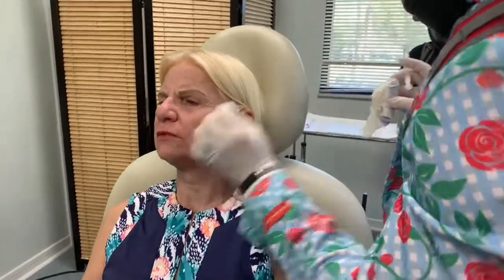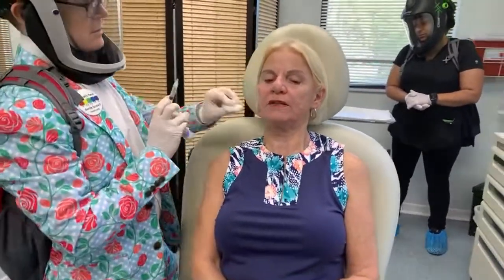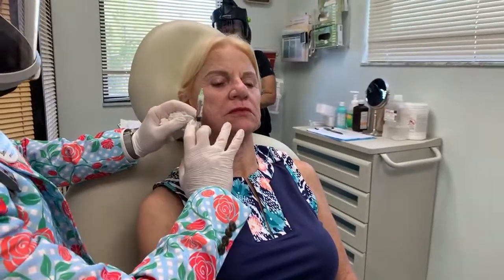And now I'm going to test on the other side. Starting to salivate. Is that normal? You might feel that salivation. Sometimes it feels like we may be drooling, but there's no drooling, I promise. Okay. Because the numbing makes the lips feel goofy. You feel a little pinching here? Not too bad? How about here, pinching? A little, but nothing. So now I'm just testing these areas and giving a little bit more numbing. Little pinch.